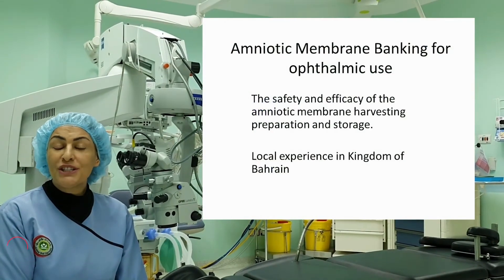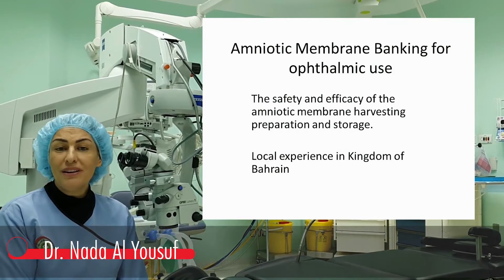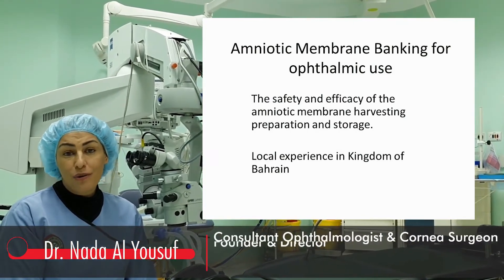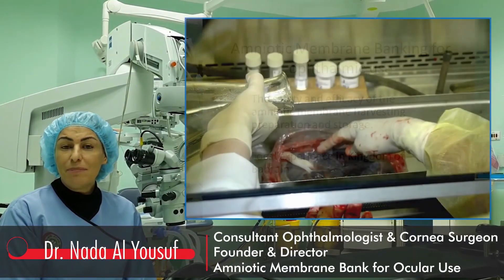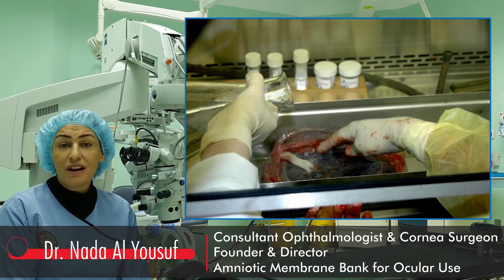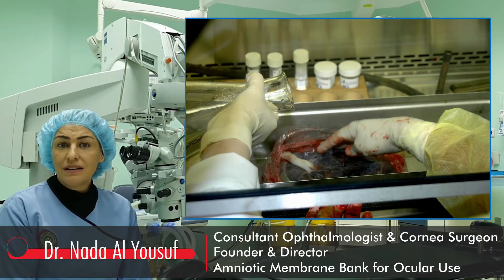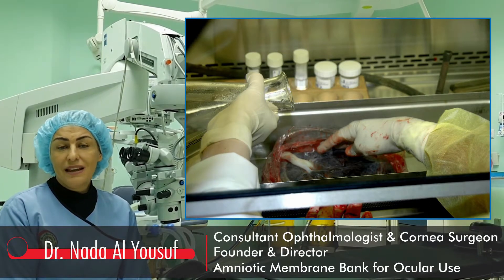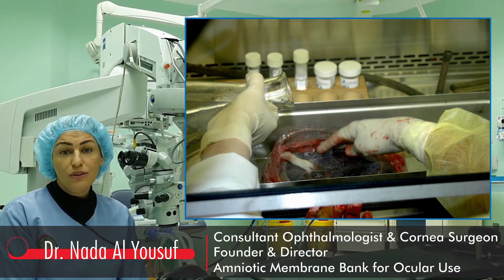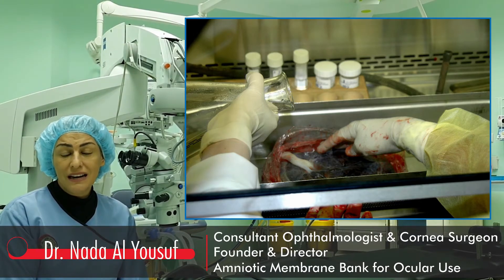This paper describes and shares our local experience in amniotic membrane banking technique for ocular use. The placenta is obtained from elective caesarean section after consenting the mother. All serological tests for communicable diseases should be negative. The placenta is placed into a laminar flow cabinet and washed with sterile saline solution.